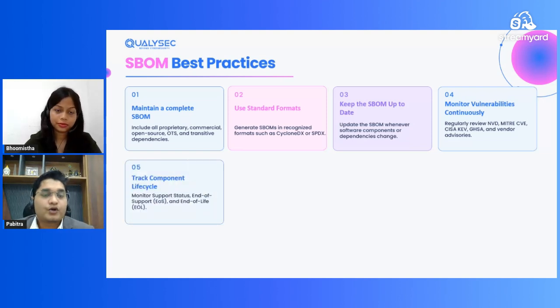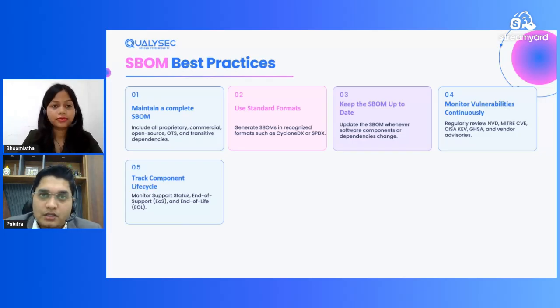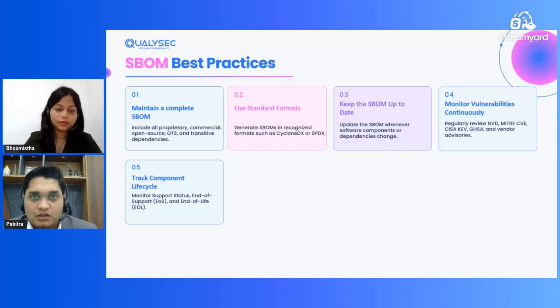Then track the component life cycle. There are multiple components that you may use, knowingly or unknowingly. There might be end of life, end of support. We have to monitor it, and this is very crucial. Let's assume whoever developed that component announces that it's end of support. Then in future, how are you going to secure it? You have to have a particular plan and compensating controls around it.